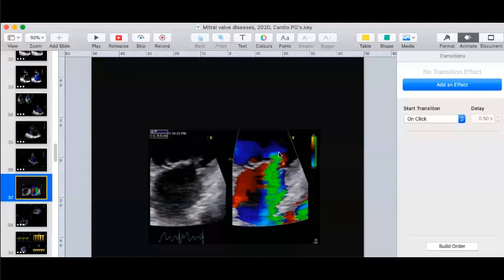And it is not going to be affected by the pressure on this side or pressure on this side, so the driving pressure, so to speak. That is the greatest advantage of vena contracta, where it is not affected by the flow going across this orifice, nor is it going to be affected by the pressures, especially the driving force pressure. And as you said, it is the narrowest portion. It is just below the anatomical orifice. So if this is the anatomical orifice, the vena contracta will be just below this, and it is always going to be smaller than the anatomical orifice.